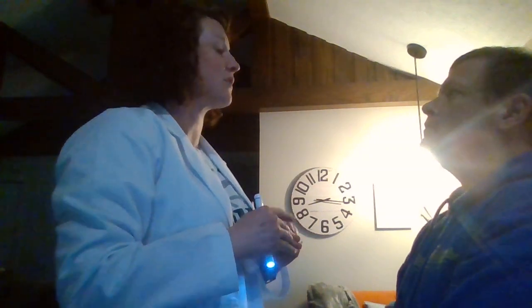I'm going to do the same thing from the side angle because I want to look at your irises and make sure that they are well defined, that I can see almost the whole iris and that there's no shadow that's cast. And I see the well-defined iris. There's no shadow, and I can see almost the whole thing. That means that your anterior chamber is deep, which is good. And same on this side, your iris is well-defined. There's no shadow, and I can see almost the whole iris, so your chamber is deep.